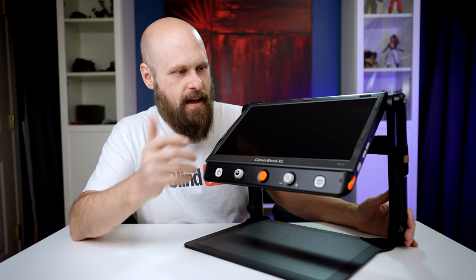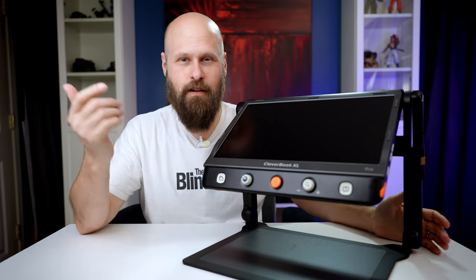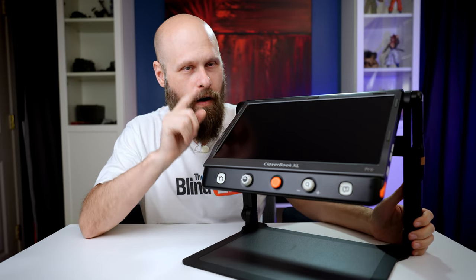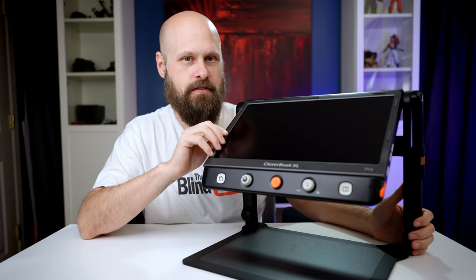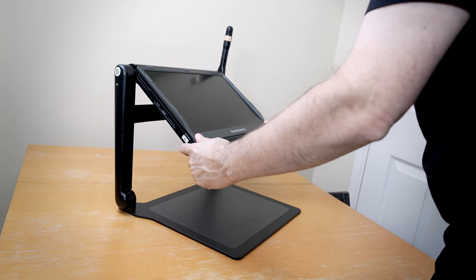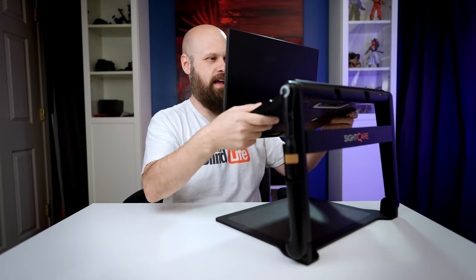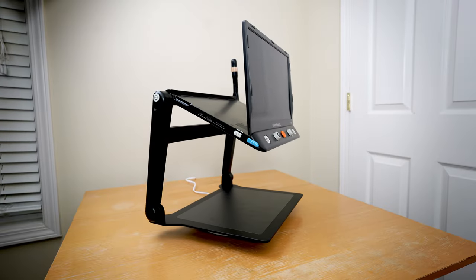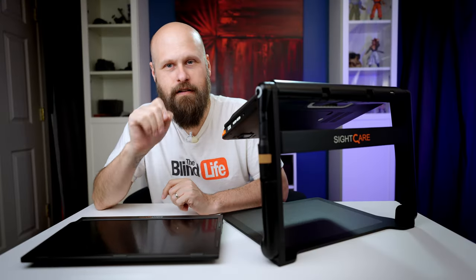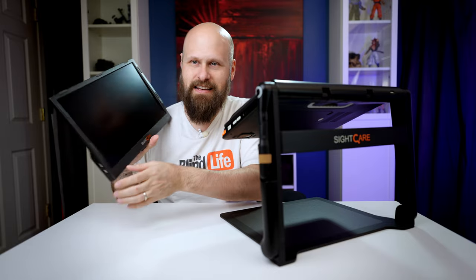You might be thinking, what did they change? It looks exactly the same as the CloverBook Pro. Well, other than being much larger — the CloverBook Pro was a 12-inch screen and now we have a 16-inch screen — they've improved one very important thing: the screen raises up. So now you don't have to look down onto the screen; you can raise it up and it's right in front of you. This makes it so much easier to see the complete image. The Pro part brings in the extra screen, also a 16-inch screen, which works exactly the same as the previous model.